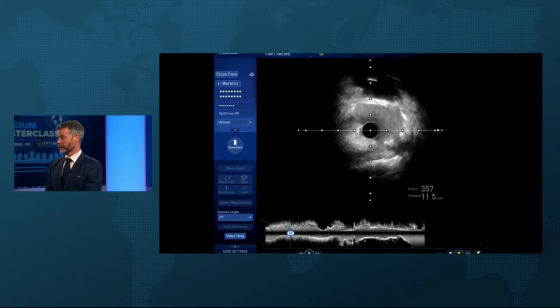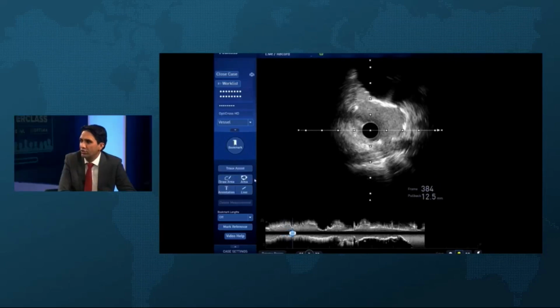That's a classic. So you've just deformed the nodule, and the nodule's deformed, and that's the key. And you've got a good MSA. You can see a big circle at the top there. We're going to talk about that a little bit later on, the deformability and the eccentricity.